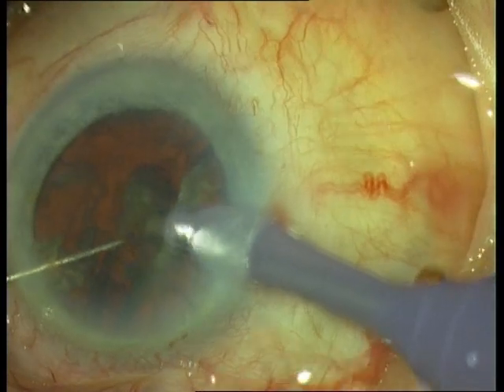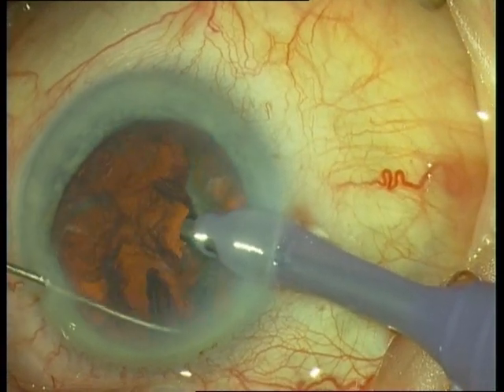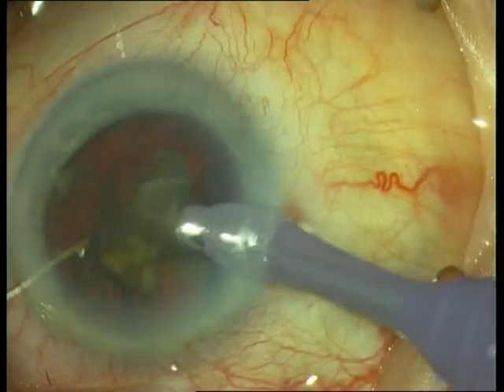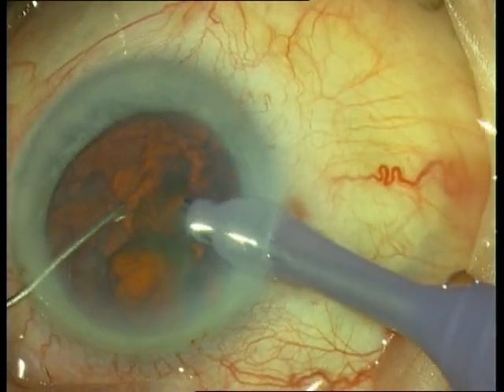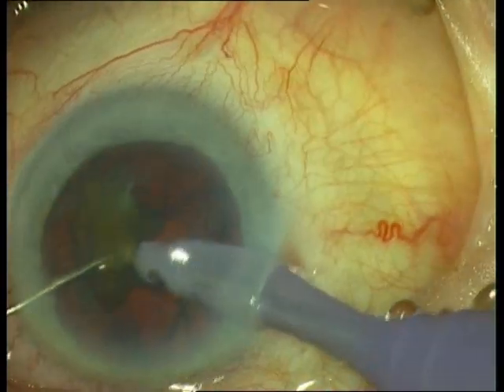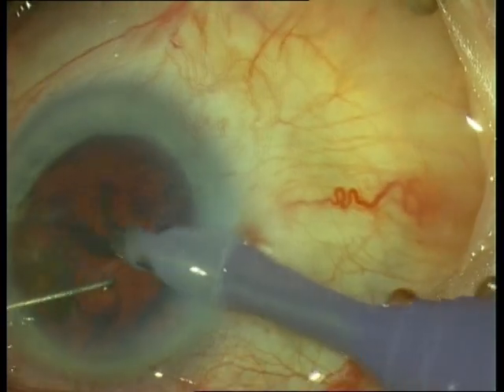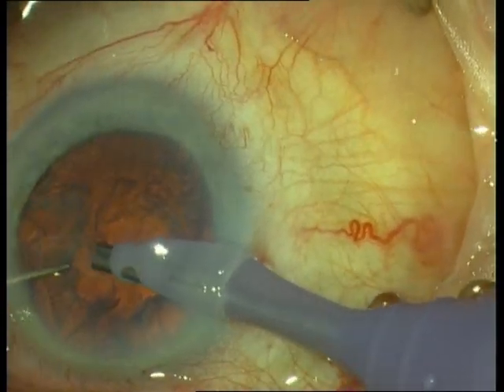Only remove the nucleus in this step. The FACO tip remains always in the middle of the eye and the push-pull, or the manipulator, feeds the FACO tip with the nuclear fragments. The FACO tip on its own remains stable in the middle of the pupil, and the manipulator feeds the FACO tip with the nuclear fragments. Be careful that the posterior capsule is not aspirated into the FACO tip.